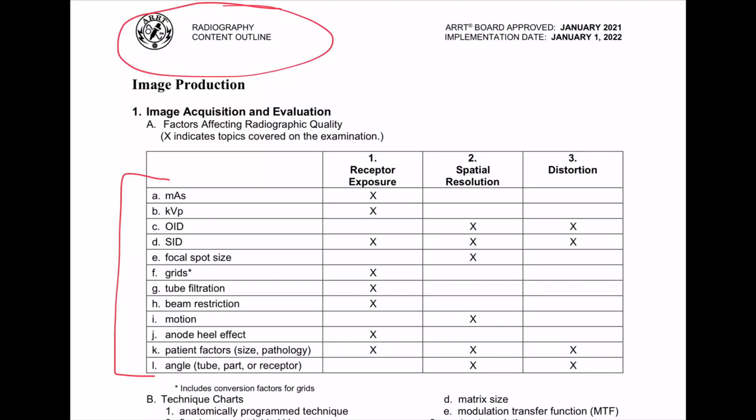This week we're going to continue the conversation about digital imaging. I know we've previously discussed some stuff about exposure indicators. We're going to now talk more on the technique side about how to make those changes to get the exposure indicator that we want.